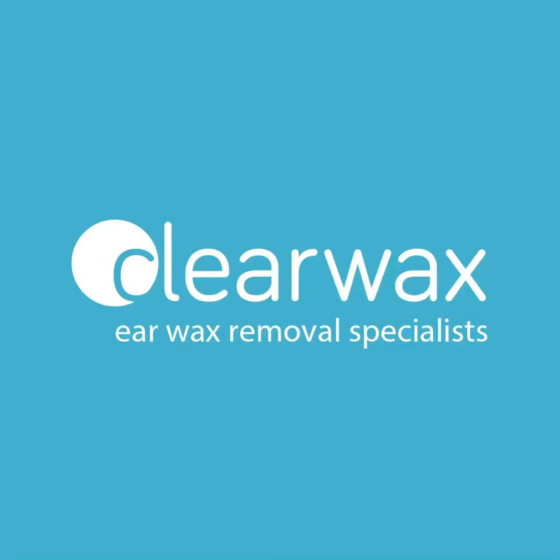and let all these drops drain back out, because you want the wax to move away from the eardrum. If you don't drain the ear, there's always a risk of that wax running downwards towards the eardrum, sticking to the drum. So always come back the other way for the same time period, for 5 minutes. So I hope that helps with that question.